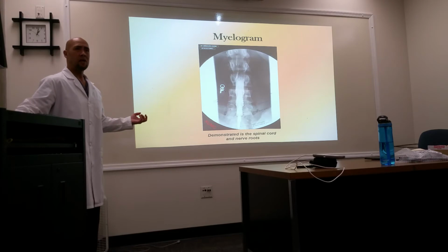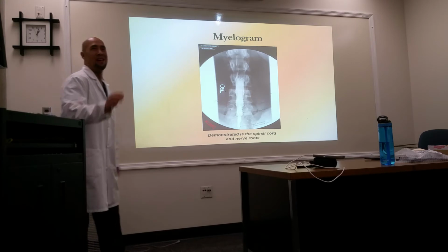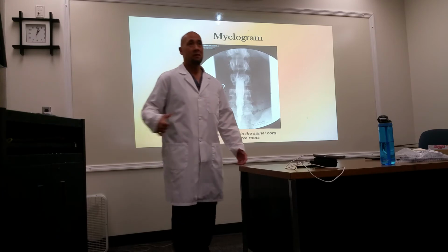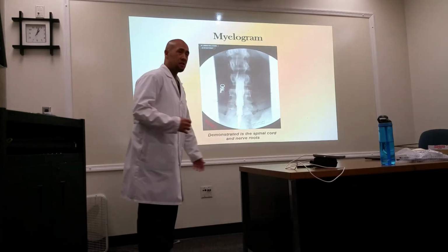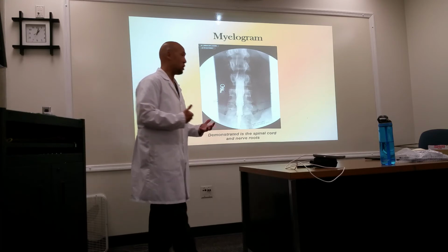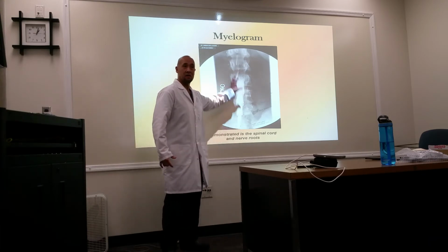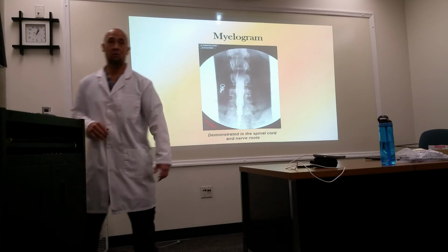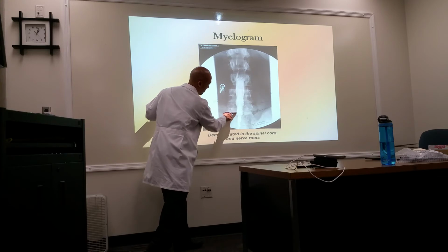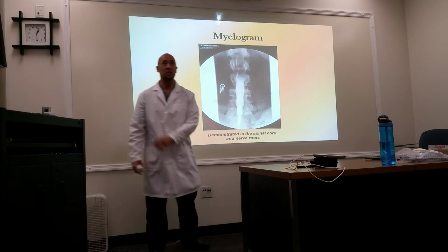Has Ms. Mintz talked about myelograms? Not yet. Okay, she will, so I'm not going to spend any time on that. I'm just going to introduce you. Basically, what a myelogram is, they go with a spinal needle in your back, very similar to that of an epidural. But instead of injecting medication or steroids in your spinal cord, they're injecting contrast. So you see an outline of the myelin sheath of the spinal cord. This helps them visualize the different nerve roots coming off the spinal cord to see if there's any problem there that's causing your pain or numbness.